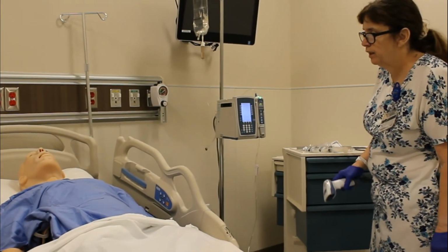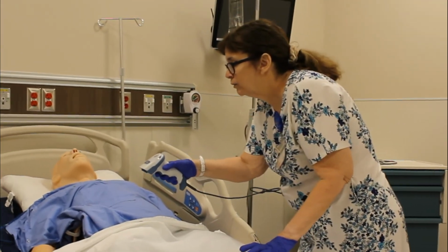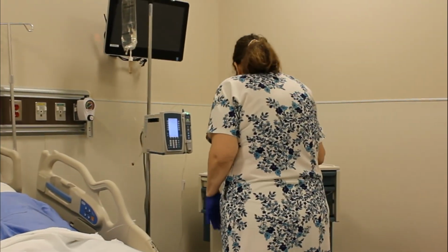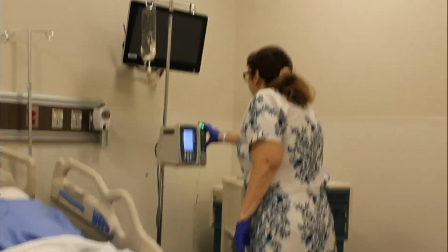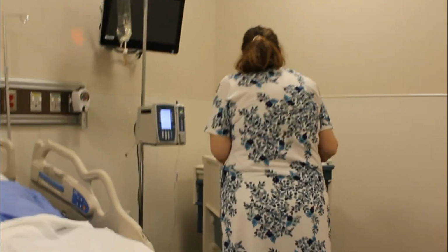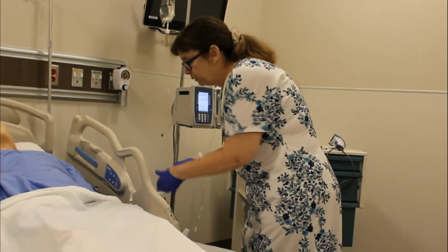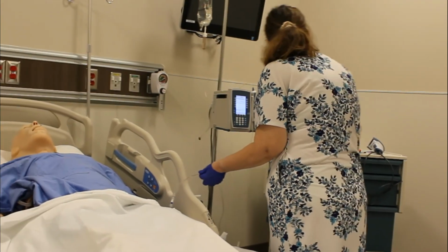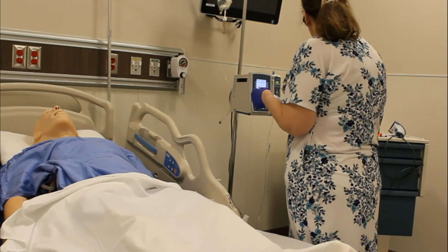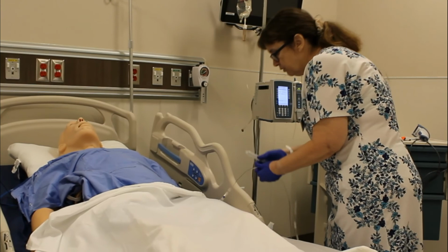All right, and I'm going to demonstrate how we would give one of the medications IV push. All right, can you tell me your name and date of birth, please? Now I'm going to put my IV on hold so that I can flush it. I'm going to give the medication in the port closest to the patient. I'm going to start with a flush. This is a peripheral IV, so I only need to flush with about 3 mLs of solution.